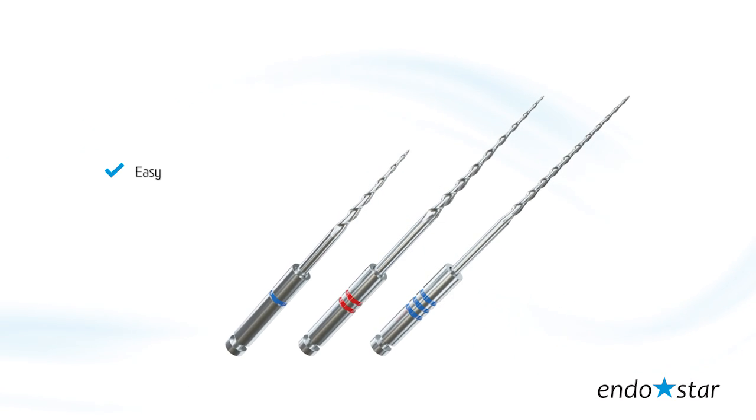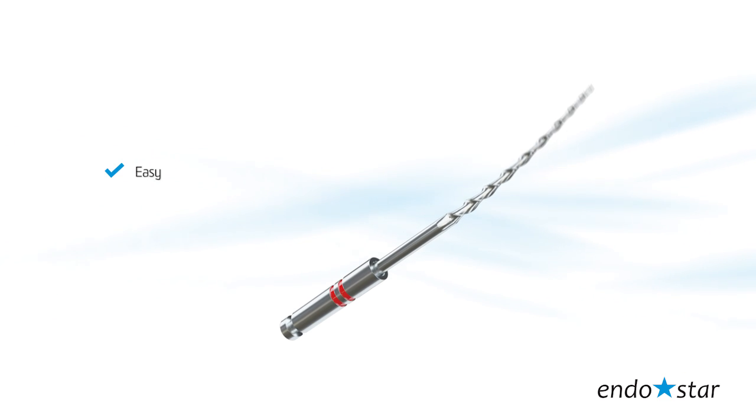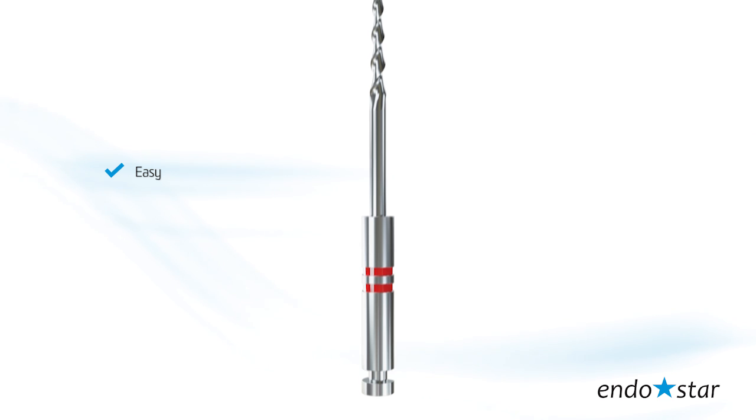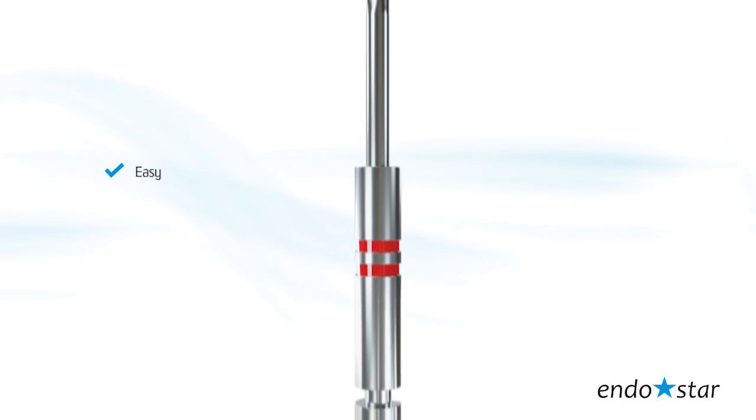Easy. Easy sequence means working with three selected files. The small number of files ensures an easy working sequence and high efficiency of preparation of most root canals.